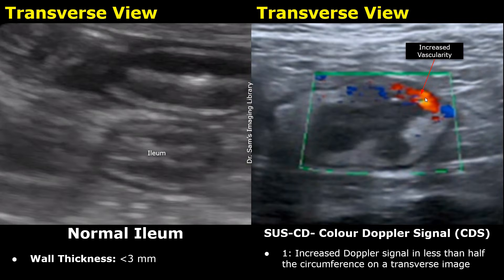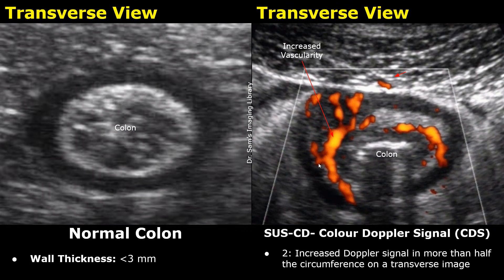The second parameter is the color Doppler signal. A score of 1 is given if the color Doppler signal is seen in less than half the circumference of the bowel loop on the transverse image. For example, if Doppler signals are only seen in the upper half of the circumference, that is less than half, so one point is given. Two points are given for increased Doppler signal in more than half the circumference on a transverse image.